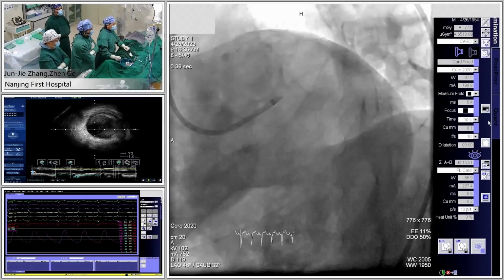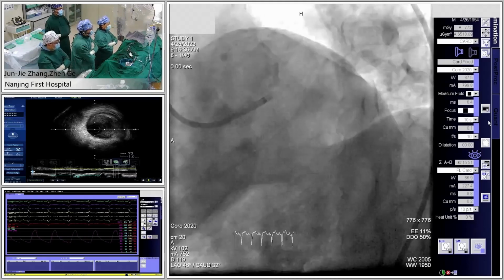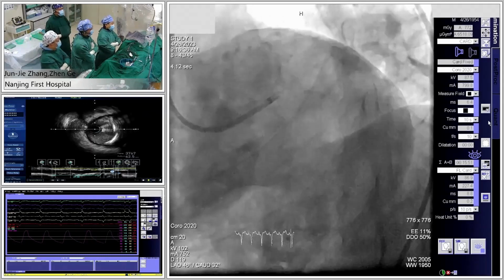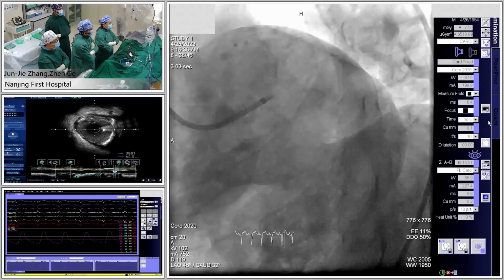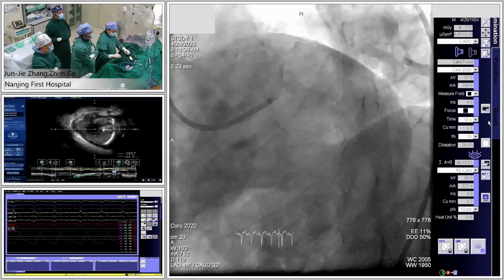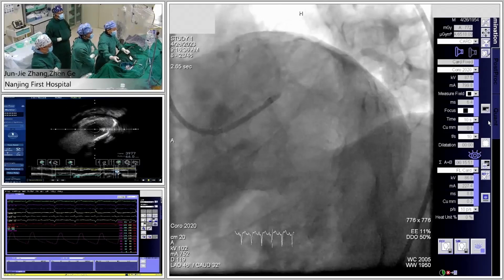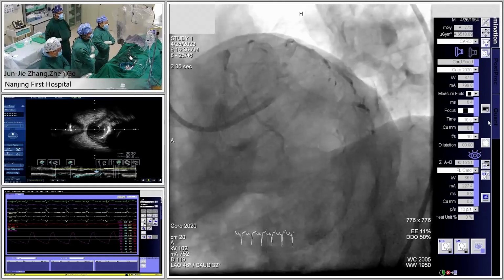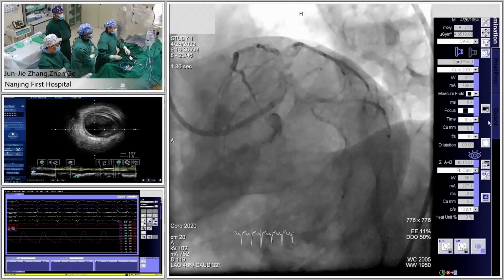But another issue is the very severe calcification from the distal left main to the mid LAD. So what's the strategy for this calcification? Rota or other devices? Probably intravascular imaging will give us important information to guide us in using this tool.